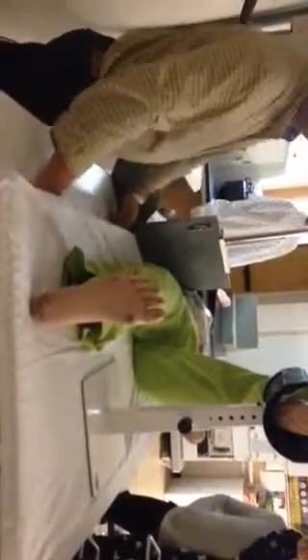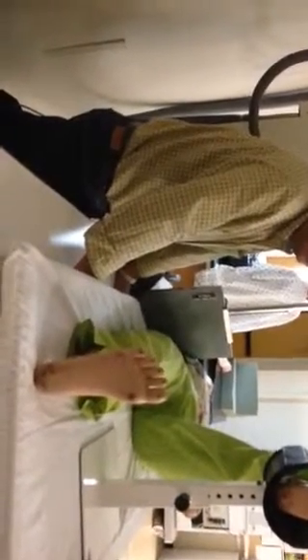Where do you shoot? I mean, where is your goal to shoot? Through the neck. The neck is right here. How do we find the neck? The same way as the other one? It's the same way as you did with the AP, which is what way? Tell me. The pubic symphysis, the ASIS, and the iliac crest, and create a triangle. Not the iliac crest. ASIS, pubic symphysis.